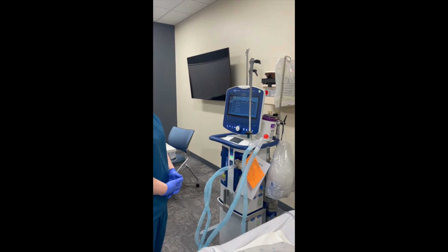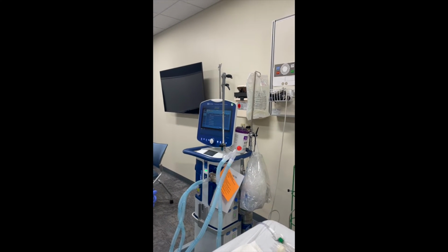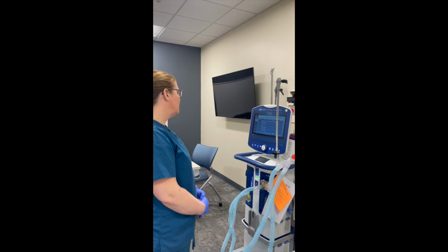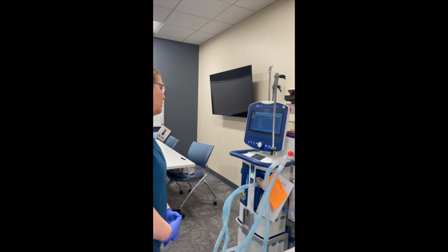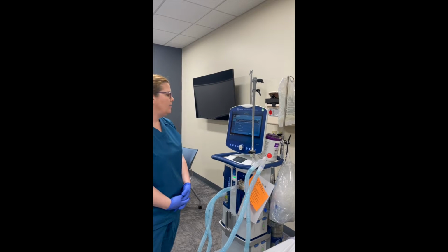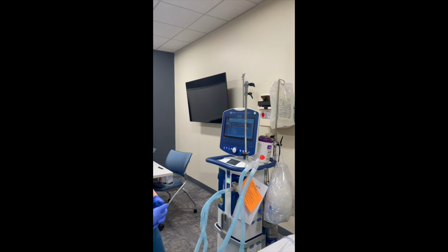So it's testing the SST flow sensor cross check. Testing air. EV performance, that one has passed. Now it's checking the SST circuit pressure.